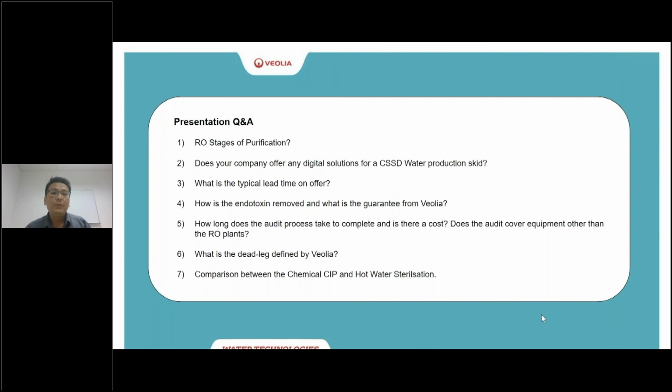It's easy to generate, remove and verify, because like presented by my colleague Cameron, we have several temperature sensors to test the water temperature during sterilization processes. If the loop operates at 65 degrees Celsius and above, it is considered self-sanitized. On top of that, we may consider another continuous sanitization method for the cold loop, which is ozone.